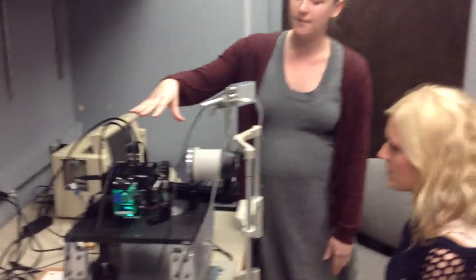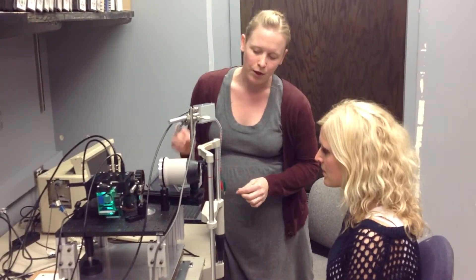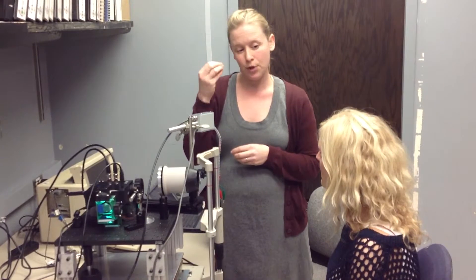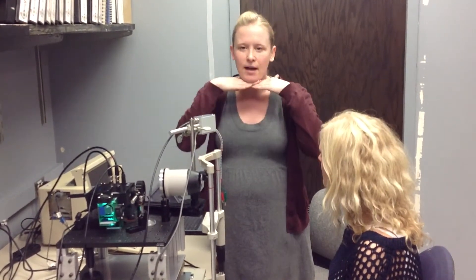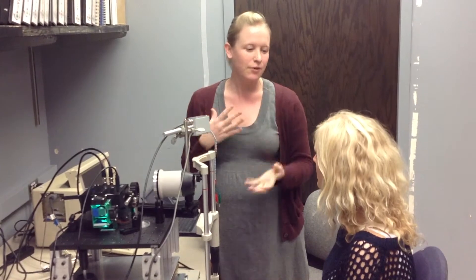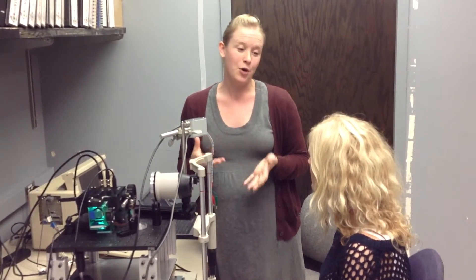Now we want to demonstrate the ERG, and this is Elise. She's never had an ERG before, so she's volunteered to be our subject today, and this is very much how we would do it with the children. This machine has three different colored lights. We're going to get you lined up so your chin is resting on the chin bar and your right eye is level with the eyepiece. What you'll see in there looks like a bull's eye, and we'll get it lined up so all the light is shining right through your pupil. We want to know what colors your eye responds to best.